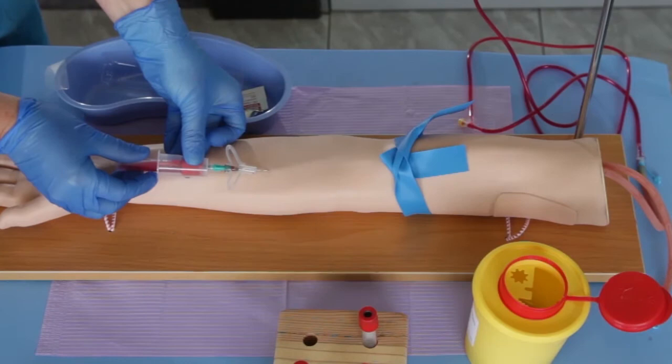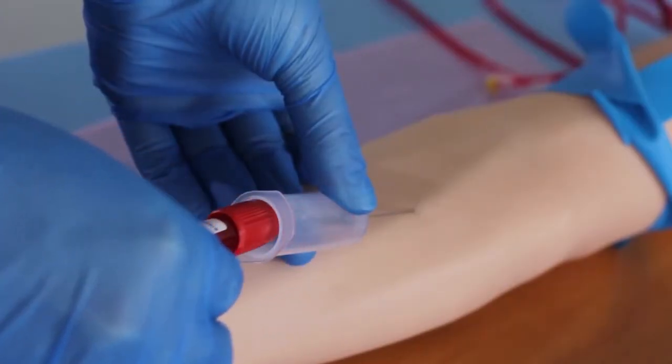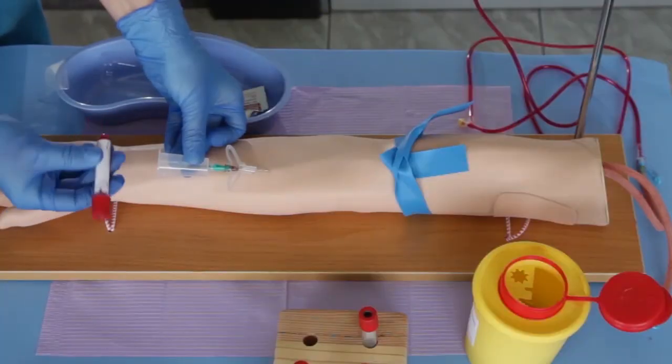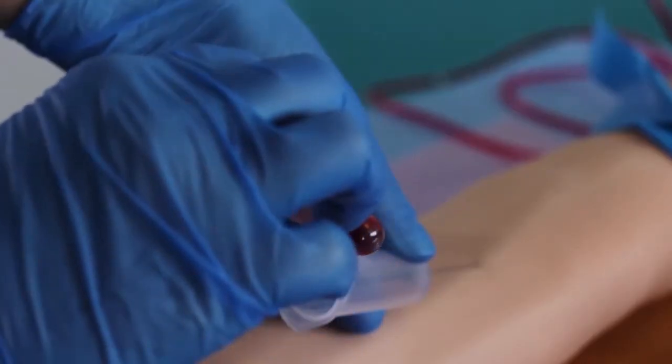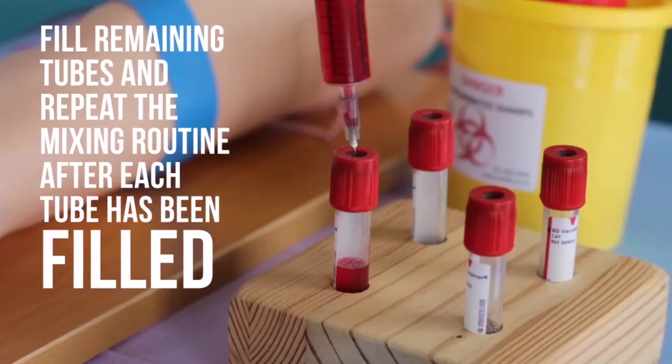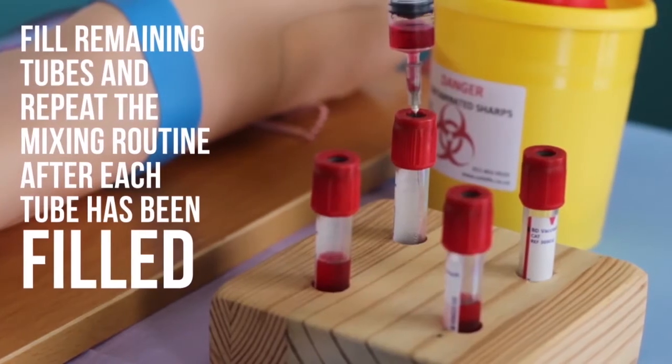When blood flow stops, remove the tube by holding the hub securely and pulling the tube off of the needle. If the tube used has additives, mix the contents by gently inverting the tube five to eight times. Do not shake. Fill remaining tubes and repeat the mixing routine after each tube has been filled.